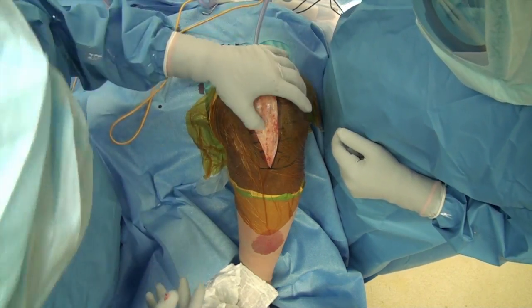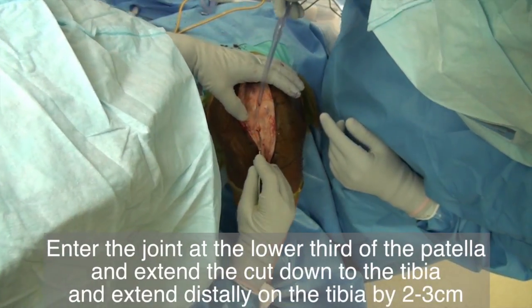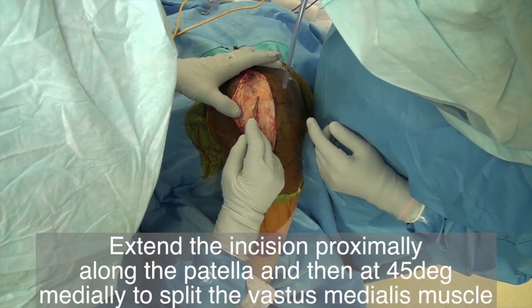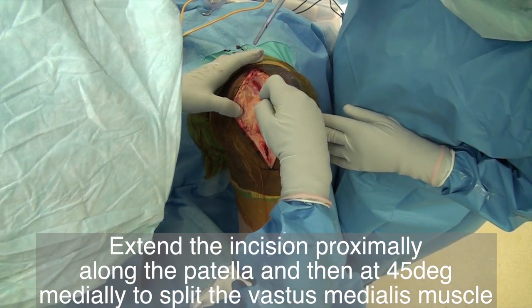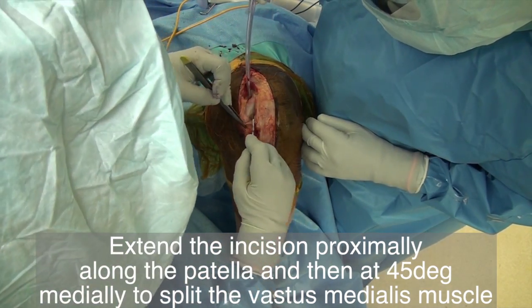Enter the joint just medially to the patella ligament and extend the incision down to the tibia. Invert the blade and carry the incision from distal up on the tibia, extending the incision by another two to three centimeters. Extend the incision proximally along the patella. Split the vastus medialis muscle at a 45-degree angle, then finish opening the joint.